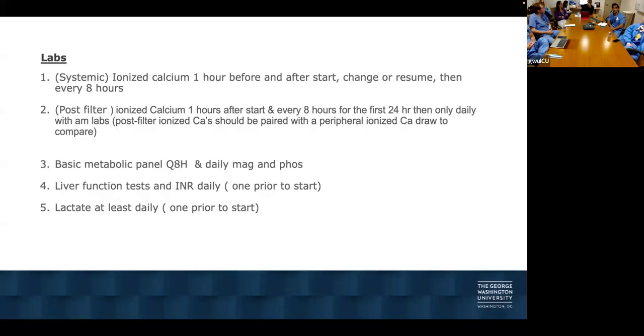Is this something in the generic order sheet or set, or is nephrology going to order it? Yes, it's the order set. Nephrology just needs to know it's happening. The nephrology fellow, it's all attached in one favorite order, and they click one click and that all comes together.